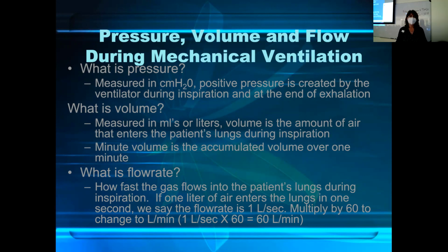Pressure is measured in centimeters of water. Positive pressure is created by the ventilator during inspiration and at the end of exhalation. So during inspiration, when we're pushing the air into the lungs, pressure builds up. And then at the end of exhalation, we usually keep a positive pressure in the lungs. It never goes down to atmospheric pressure or 0. There's always going to be a little bit of positive pressure kept in the lungs.